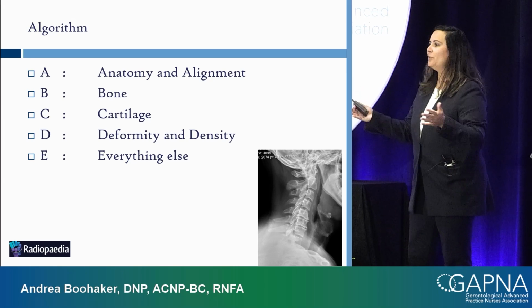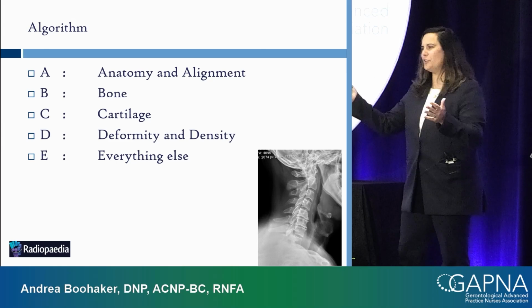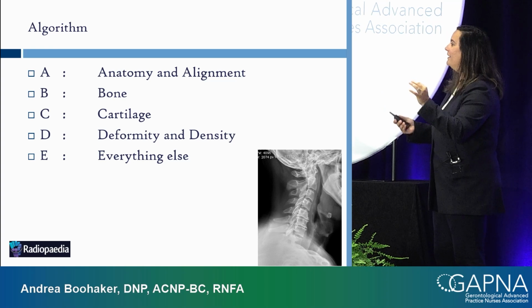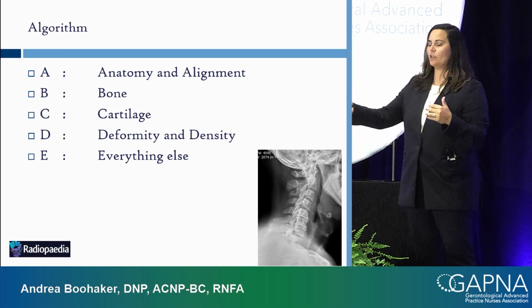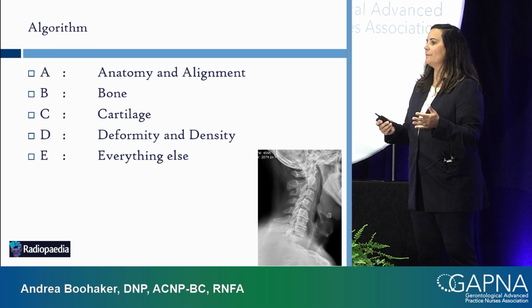B, the bone. Oh, duh. All these orthopods running around. Broken bone, fix it. I'm sure you guys have seen the YouTube memes. Like, it's not hard to make fun of orthopods. But x-rays are meant to look at bones, okay? As we go through this algorithm, you'll start to understand that it's really not just about the bone. But that's what your eyes should go to first.